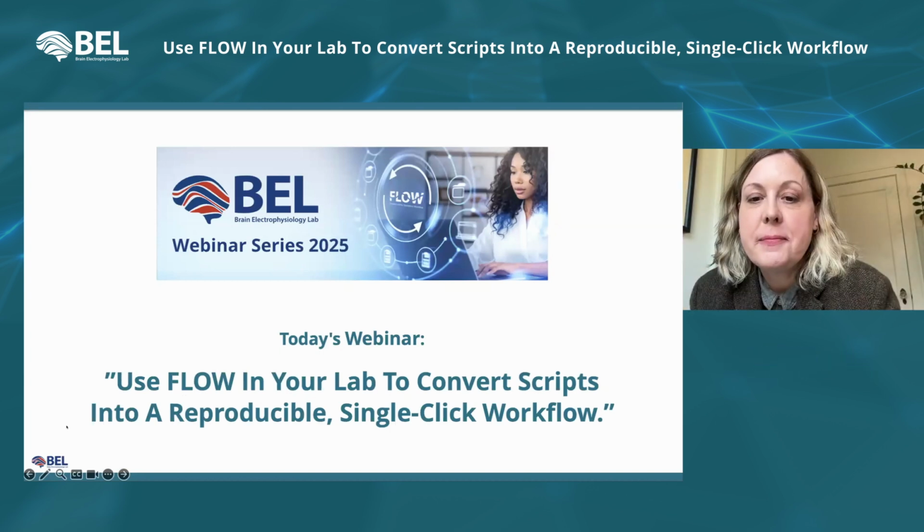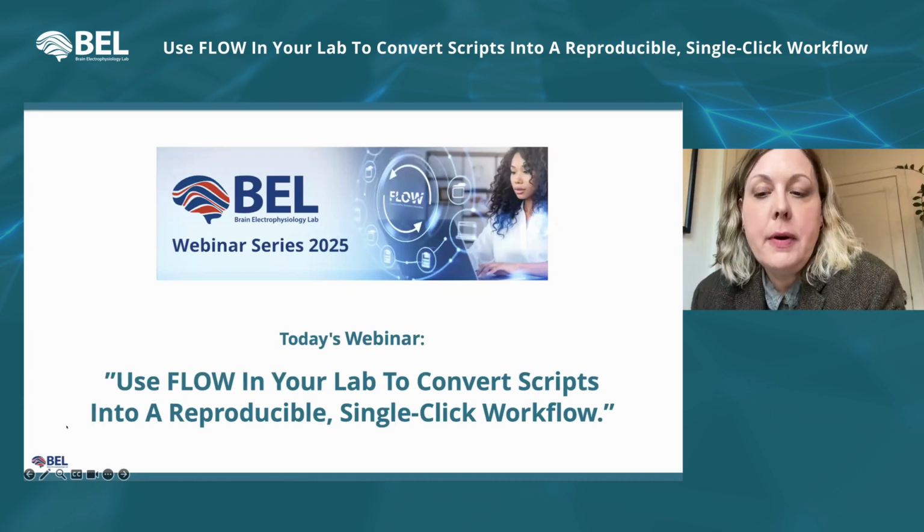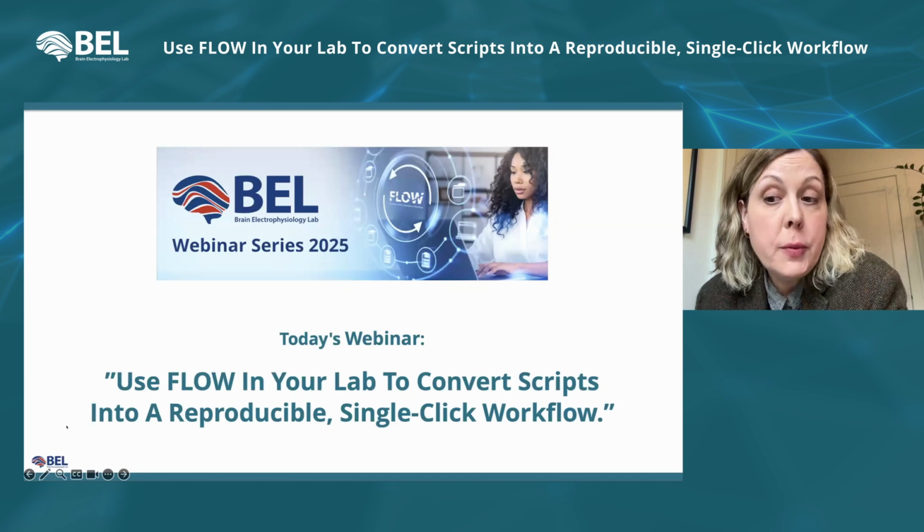That's a fair answer. Okay, next question. Can we analyze several files at once with this notebook pipeline? Yes, a user can define multiple inputs and multiple outputs, so this is not a limitation. And the next part of the question is, can we perform group analysis? Meaning, can I, for instance, generate a mean ERP for several participants?